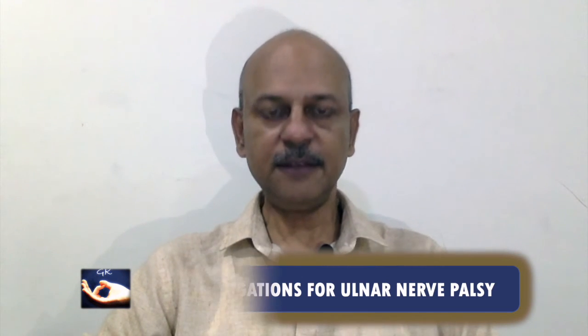So it would also be good if I could note how much of the nerve is actually conducting the nerve impulses. Only if I am able to see these two, that is, if I am able to image the nerve beforehand, and if I am able to see the physiological function of the nerve fiber, I will be able to make a correct decision about the management protocol.